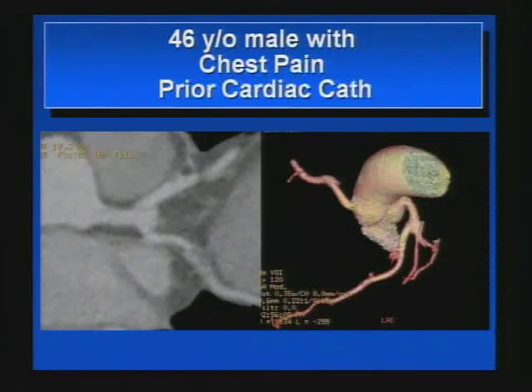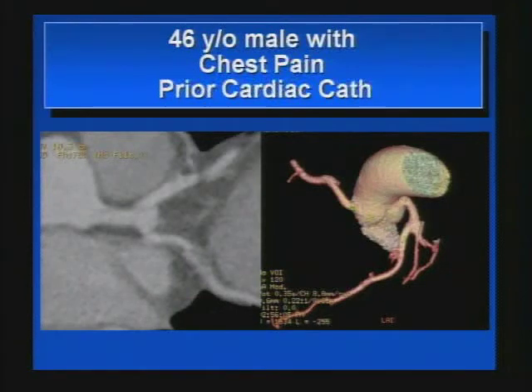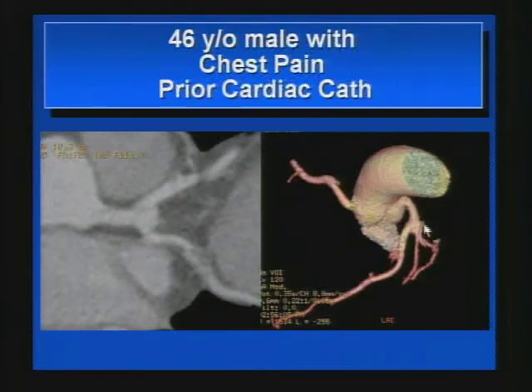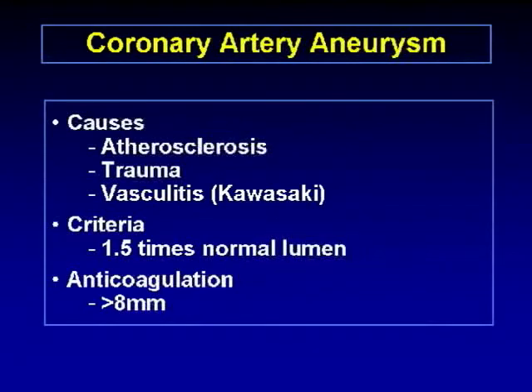Let's start with our first case. This patient is a 46-year-old who had a cardiac cath and was referred for a coronary CTA for evaluation of these abnormalities. This is a curved maximum intensity projection. We can see the left main coronary artery, LAD and circumflex, and a focal area of dilatation right at a bifurcation. In the volume render image, we again see that focal dilatation, consistent with a coronary artery aneurysm.